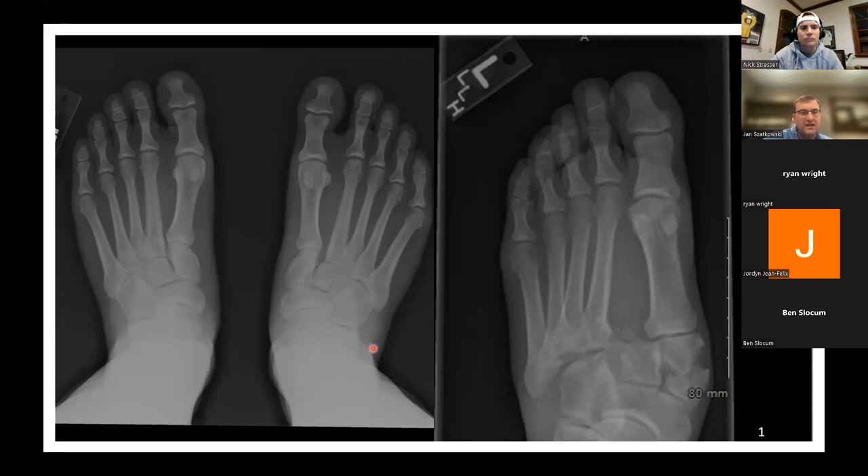On the left you have a standing AP — that means the x-ray is going down and looking directly at the foot. When we talk about Lisfranc, you can see with the laser pointer how the space between the first and second metatarsal is much wider on the right than the left. This one's pretty obvious. Sometimes it can be pretty subtle with minimal widening, but this person is weight bearing, so when they're stressing the foot you can see that difference. We're always looking for the space between the first and second because the Lisfranc ligament goes from the cuneiform to the second metatarsal.